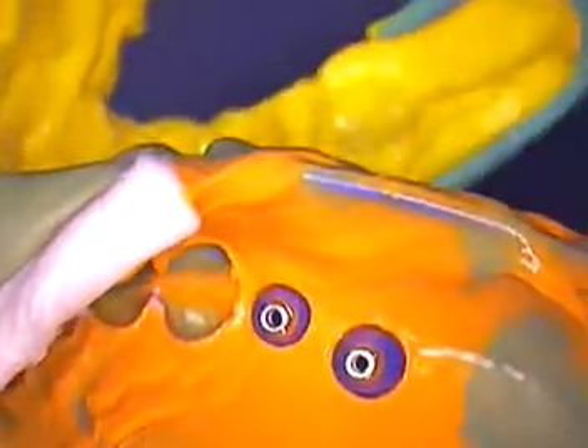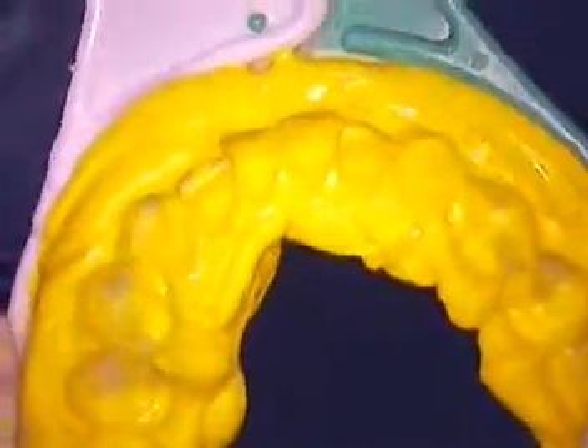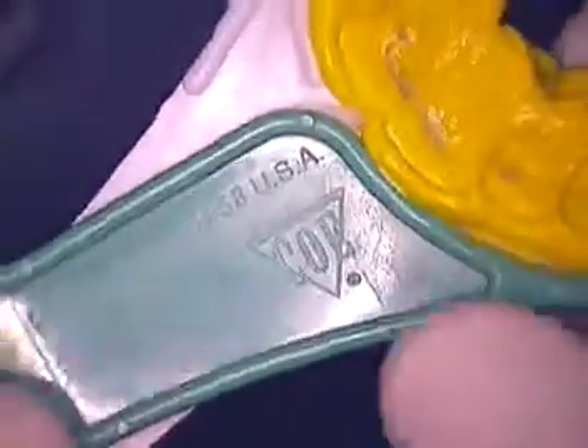Now, there are some things that you can do to troubleshoot, and I'm going to show you that. This is the full arch impression — actually, a bite registration. I like to use the code tray. You snap these two together, you take your bite registration, and sometimes I'll take and use a real rigid bite impression on one side to make sure it doesn't flex as much.